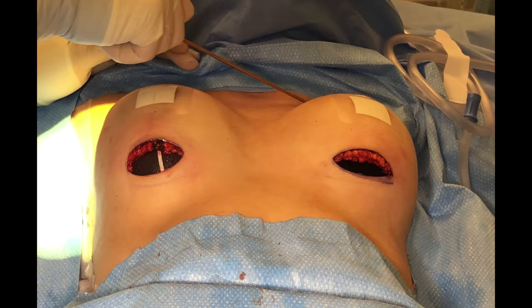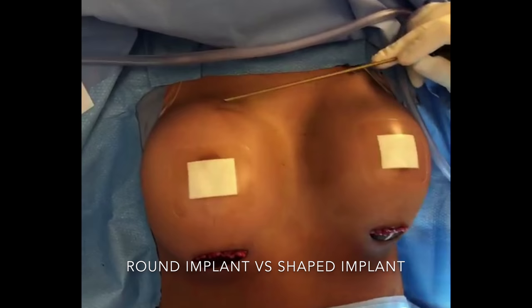Here are round versus shaped again. This is a round sizer. If you want the maximum eye-popping cleavage, this round implant is going to give you that sharp edge up here. With our shaped implants, though, you have a much more subtle takeoff.